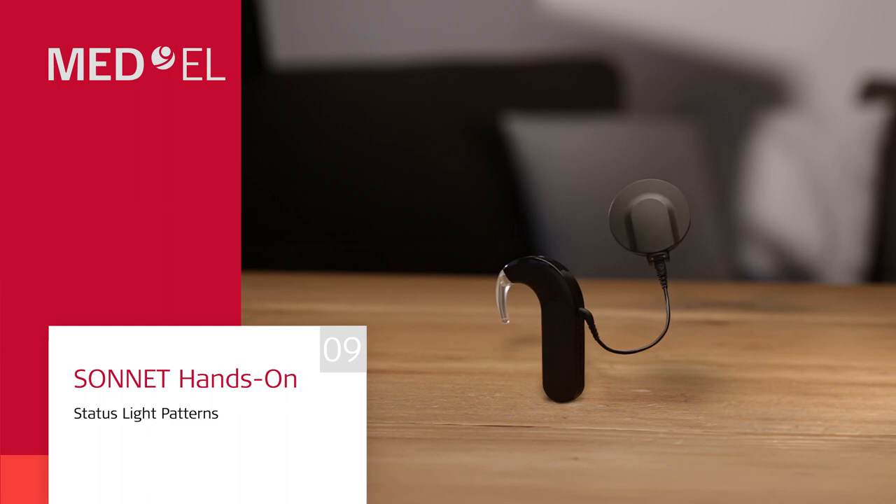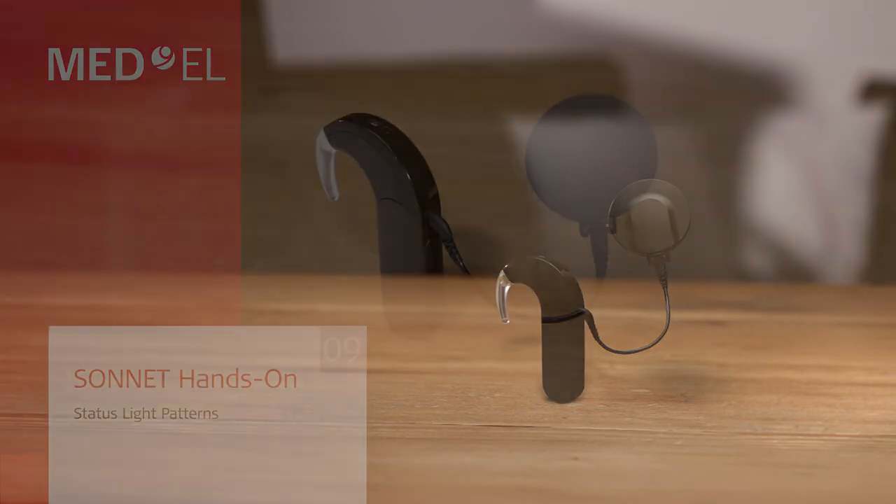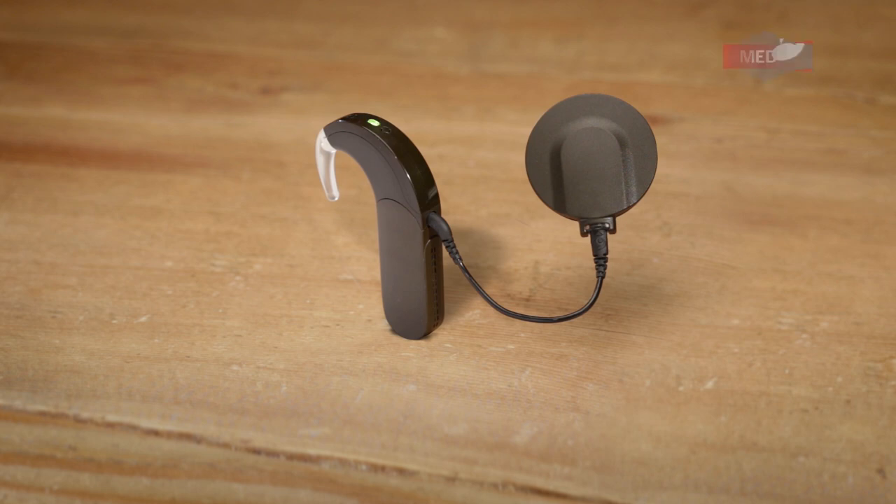Sonnet has an indicator light on top of the processor. A short green blink indicates that the fine tuner command has been successfully received. A green blink indicates that program 1 is selected. Two green blinks indicates that program 2 is selected. Three green blinks indicates that program 3 is selected. Four green blinks indicates that program 4 is selected.